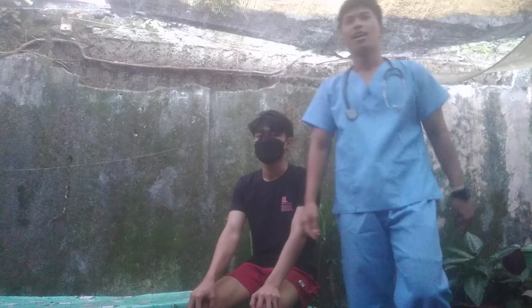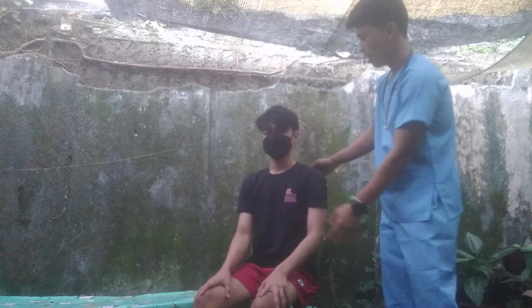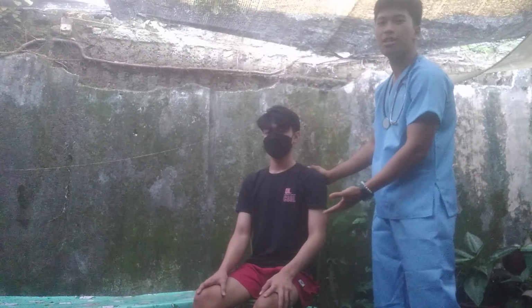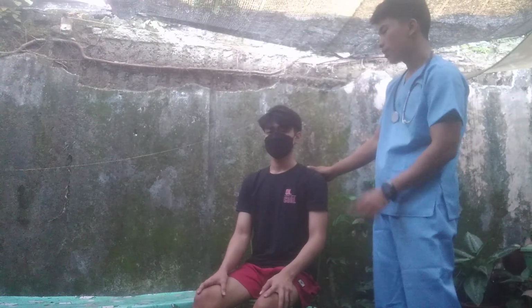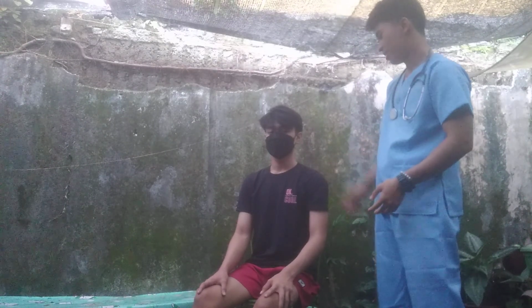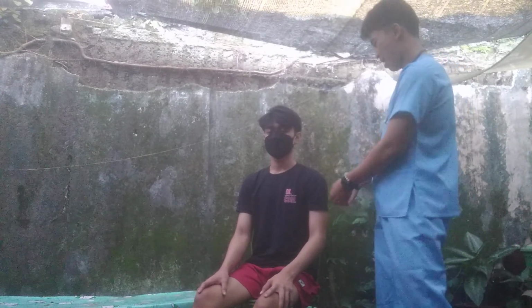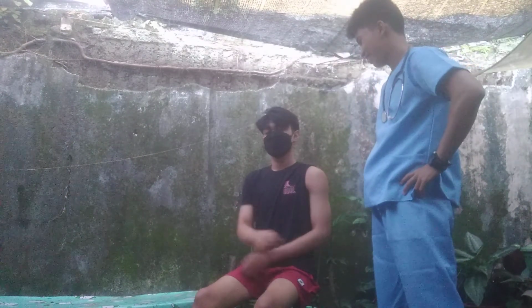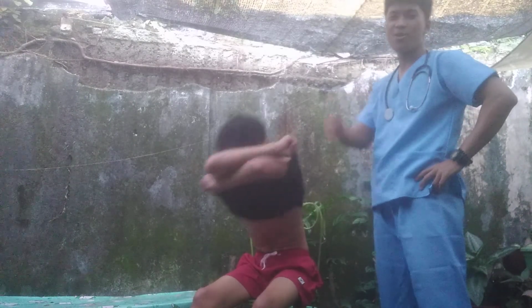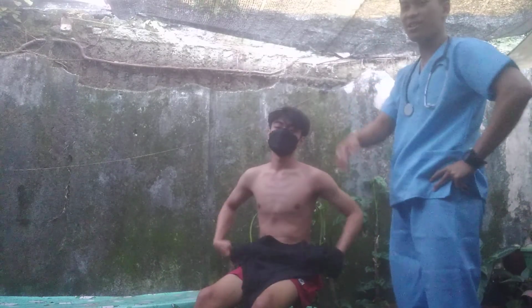Now first we need to position the patient. As you can see, my patient is in the sitting position right here, and we need to expose the axillary region. Paano ba natin na-expose yan? Maghubad na lang po siya para maayos. If the patient needs to undress, be sure to provide privacy.